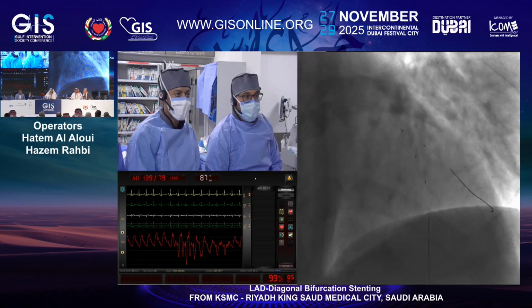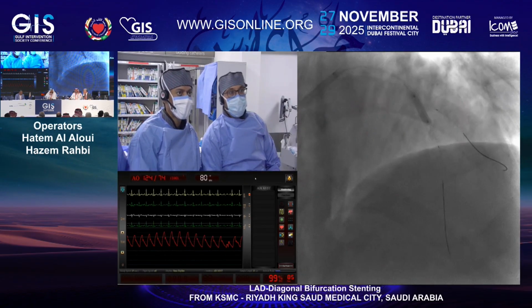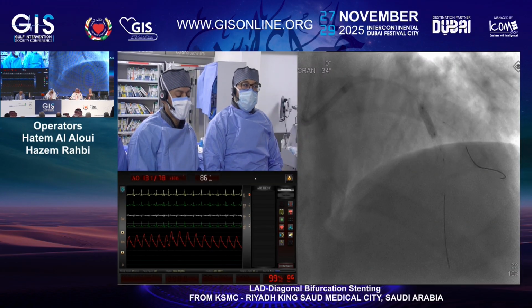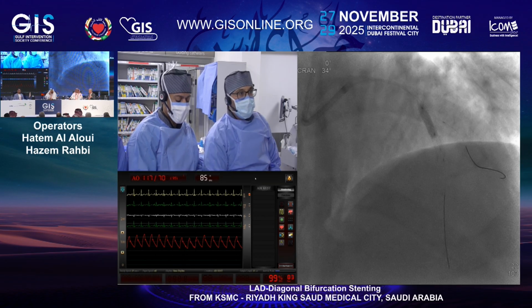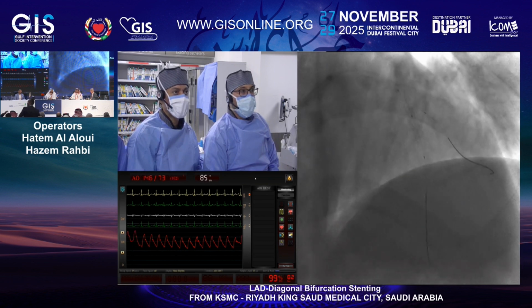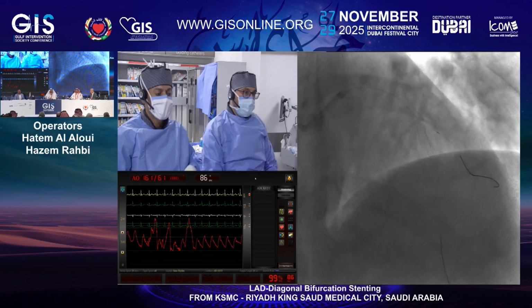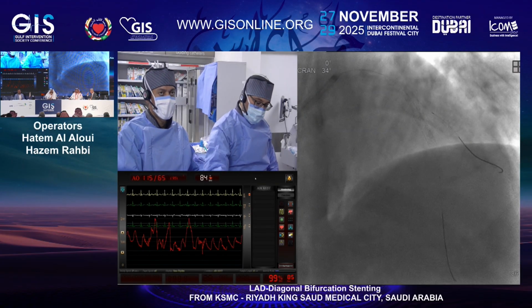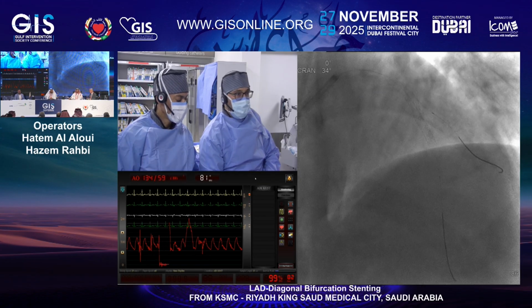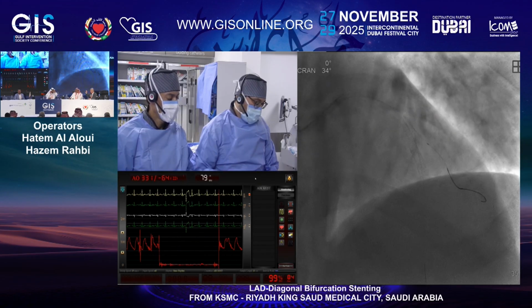Dr. Habib, what do you think about the importance of imaging? Because many of these cases we see every day in the cath lab, and sometimes we don't do imaging. In this case, it exactly showed the importance of imaging. When it is available, I think it's absolutely key. For this particular case, it has clarified many things. It has clarified that the ostium of the diagonal is not involved, which is absolutely key in the decision and the strategy decided. And it has also assessed the lesion proximal to the bifurcation.